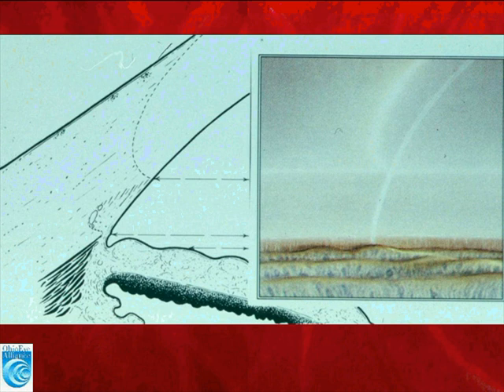Trabecular meshwork beneath Schwalbe's line, you can see, is very minimally pigmented, and if we didn't have this wedge, we might be confused as to where Schwalbe's line really is. In this series of images on the left, we can see what the angle looks like with diffuse illumination, and we can see a little bump in the iris, but by tightening and focusing our beam on that area, we can see that that is really a drawn-up area of iris with an iris process leading to Schwalbe's line.